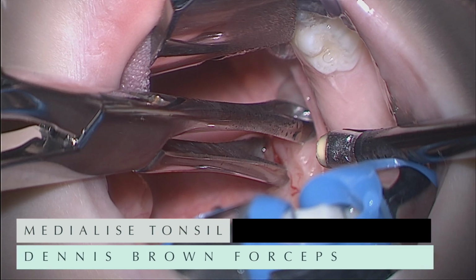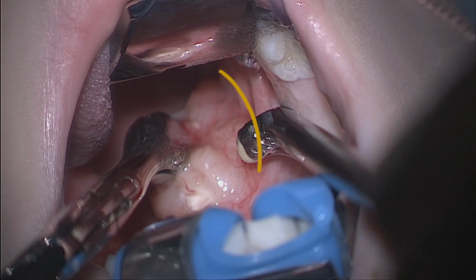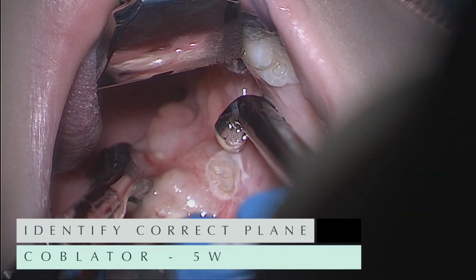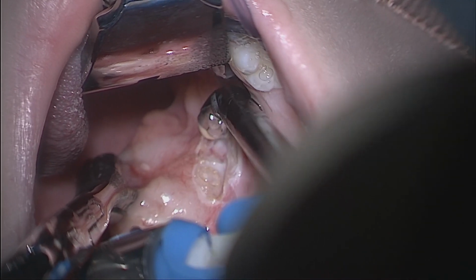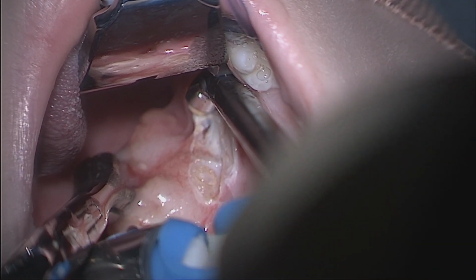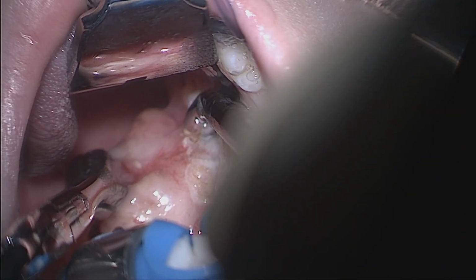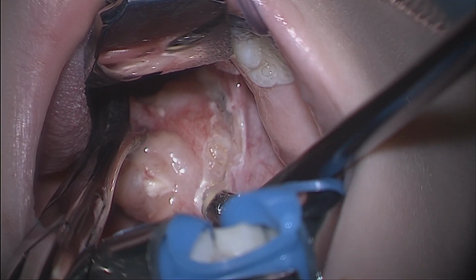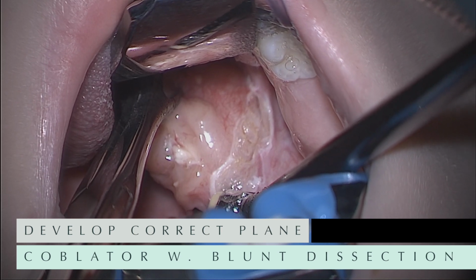We begin by grasping the tonsil and medializing this in order to demonstrate the most lateral limit of the tonsil. I begin my dissection as medial as possible to preserve as much of the anterior pillar as possible. I use the coblator to separate the overlying tissue and to get immediately onto the correct plane. This dissection is continued toward the superior pole.